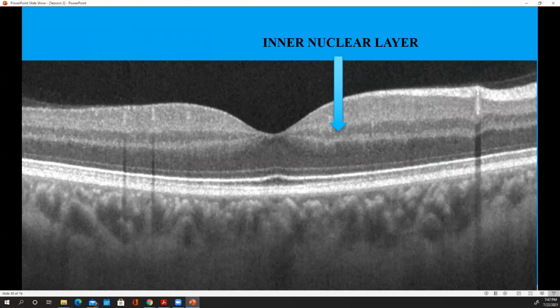So I always say, if you can just tell them it's a nuclear layer, then you can reorient yourself quickly. It's dark nuclear, got it. It doesn't change because it's a Thursday, and tomorrow this is going to be the plexiform because it's dark. No, once you learn it, dark equals nuclear, and it's inner because of that tangent line right across from the fovea, they're in line or inside of that line.